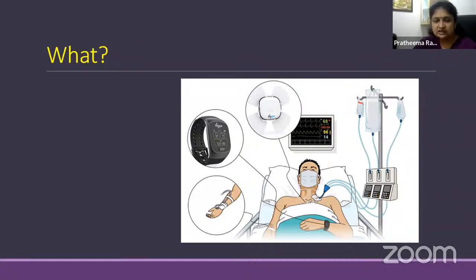If you look at just a glance, it is going to be static. We don't know whether it is moving, whether it is in circulation properly. As Dr. Aarthi comprehensively talked about all the methods of hemodynamic monitoring, we use all these monitors only to see whether the blood is getting appropriately perfused and whether the tissues are getting proper oxygen, and vice versa. Are the tissues clearing off the toxic materials, is it coming back to the heart, going to the lungs, and is the blood getting purified? This is what we need to know in a patient.